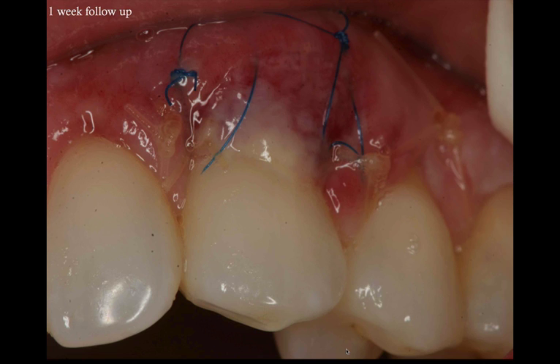She had some moderate pain from her palate that was controlled with medication. But if I look at the recipient site, we see all in all that the tissue looks red, looks vascularized, but there's a white area right in here. This is part of the graft that is laying against enamel, and this part is not vascularized at all. So there's no reason to be concerned.